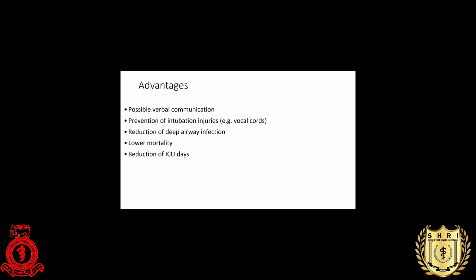These are the advantages of non-invasive ventilation in general. It reduces mortality, reduces ICU days, and also reduces deep airway infection like ventilator-associated pneumonia in ventilated patients, and also prevents intubation injuries. And if you put on a nasal mask, the patient can communicate.